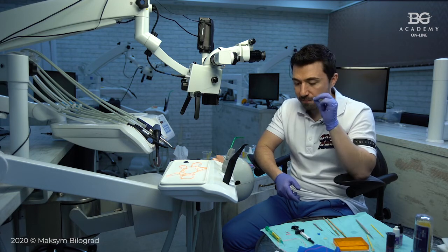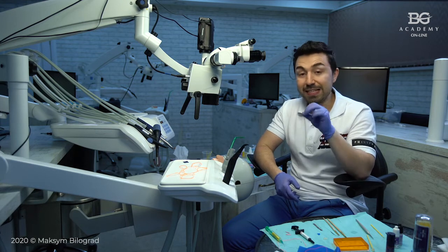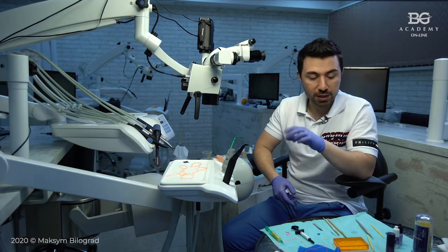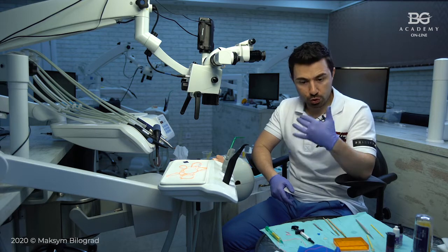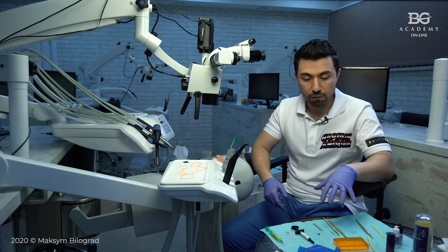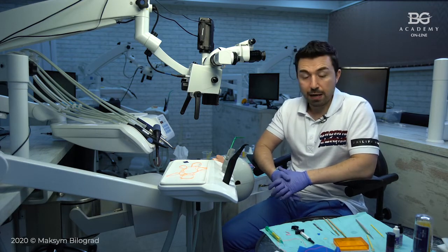frequent failure reasons of ceramic veneers is debonding. Okay, one of the most frequent reasons of failure is debonding. And when you are not using a proper adhesive protocol for the tooth surface, for the ceramic surface, and also to prepare the environment, you are compromising your adhesive protocol.